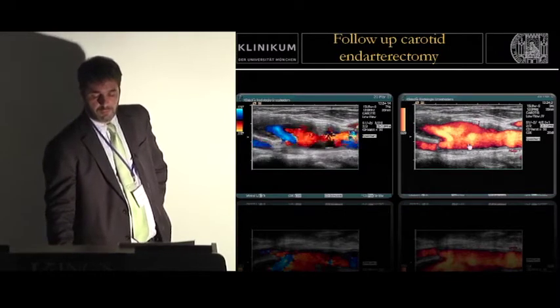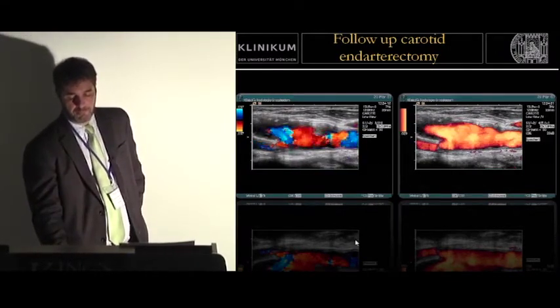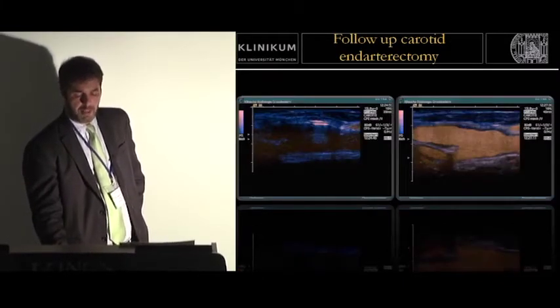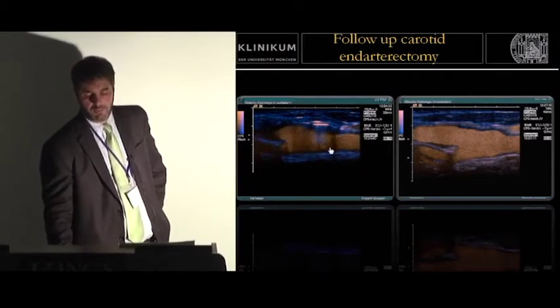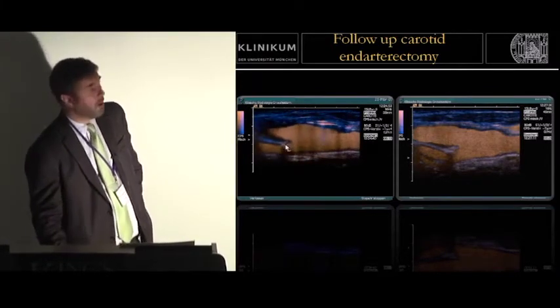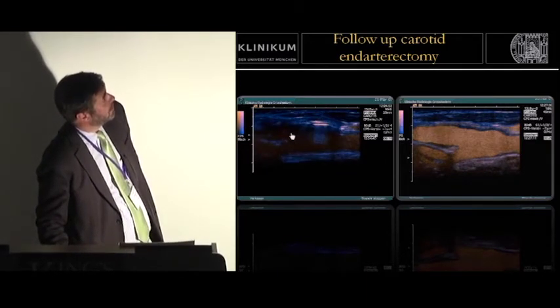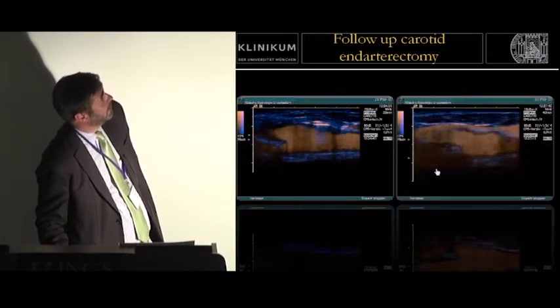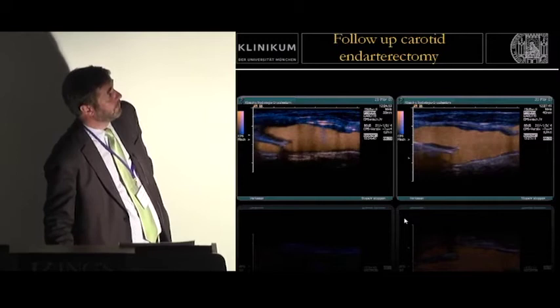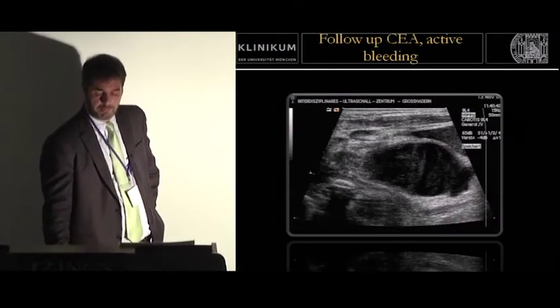The question is, how does it look now by using Doppler or power Doppler? I mean, power Doppler, you see more of the bulb. But if we now compare this by using the contrast setting, you see pretty well the complete extent of the bulb without the artifact. You see the soft plaques here, see the external carotid artery, internal carotid artery, the soft plaques here on the wall. But overall, the results are fine without the limitation as we've seen by Doppler.